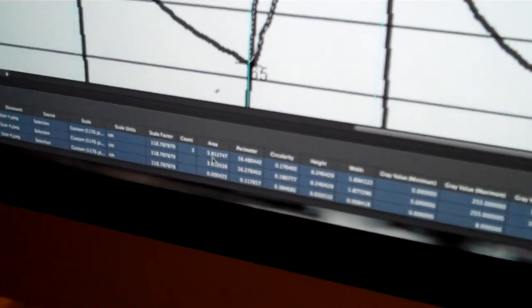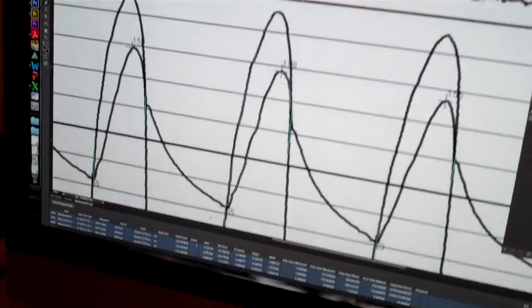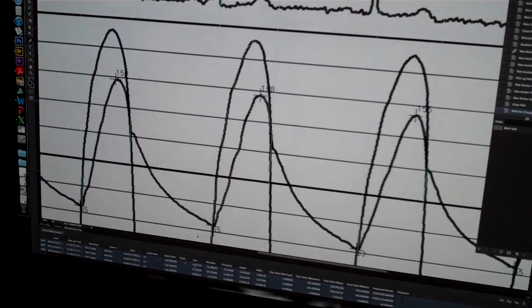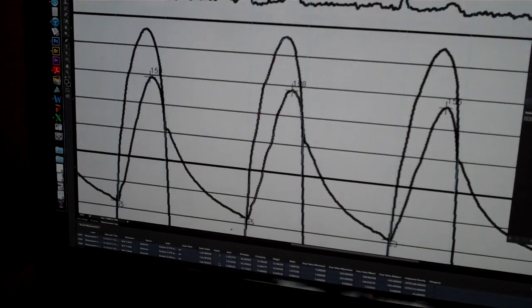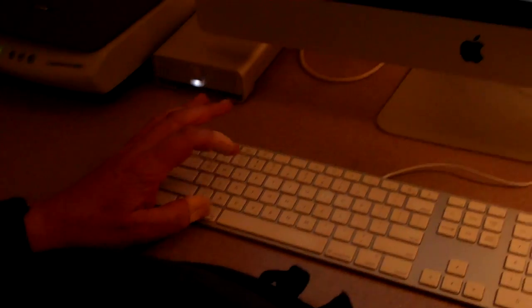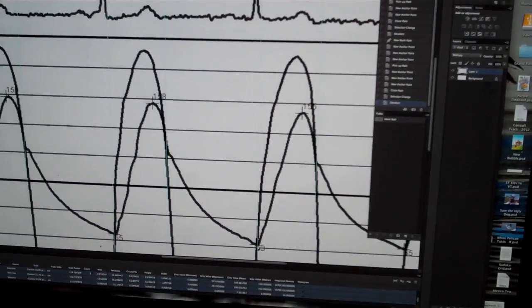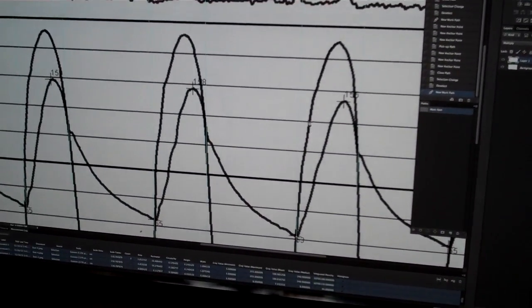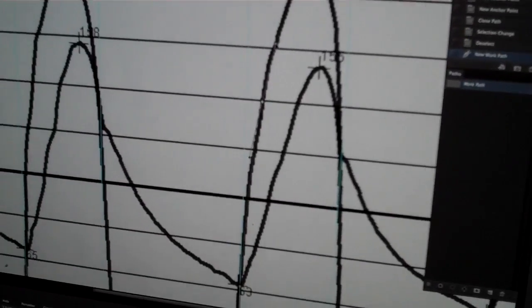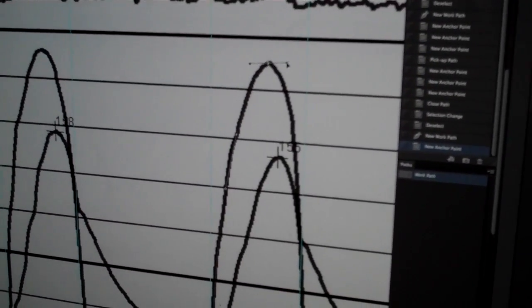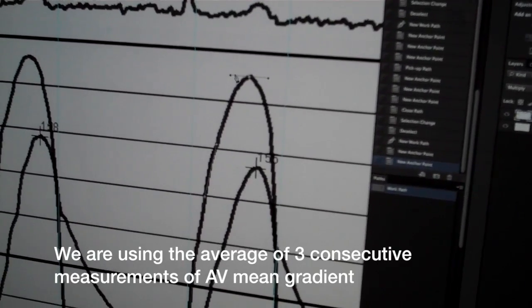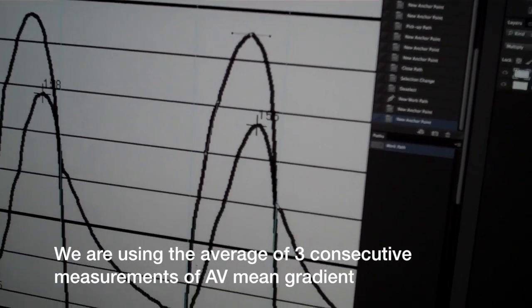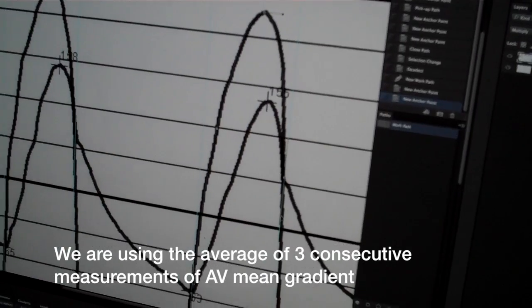So I'll go over here. Now that I know that there's no feathering selected in the selection thing here, I'll just click on this once and I'll get the marching ants. And this time I'm going to use the keyboard shortcut which is command shift M. And now the measurement number 2 here is the area is 3.8. I'm not clear why it gives me this twice. Sometimes it does that and sometimes it doesn't. But it's measurement 2, 3.8. So command D gets rid of those marching ants.